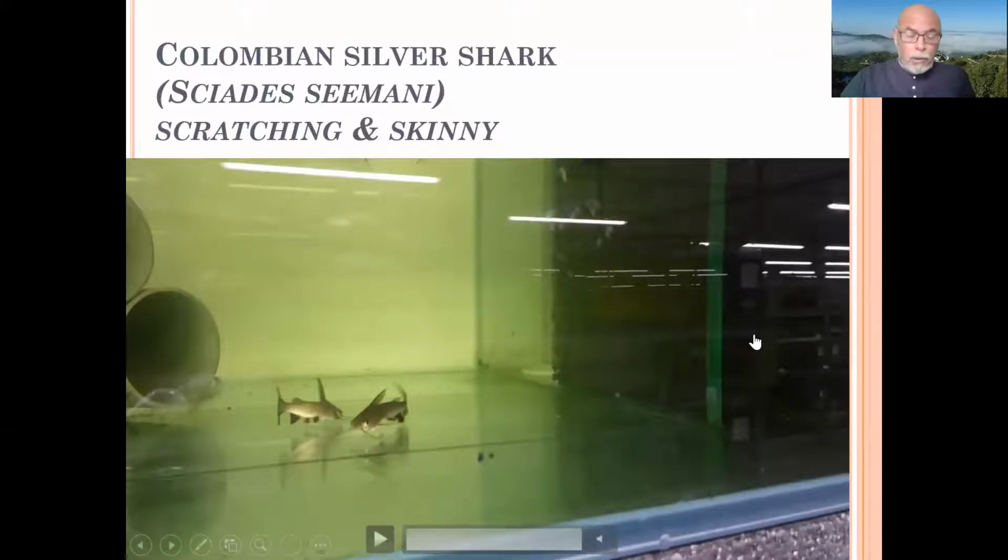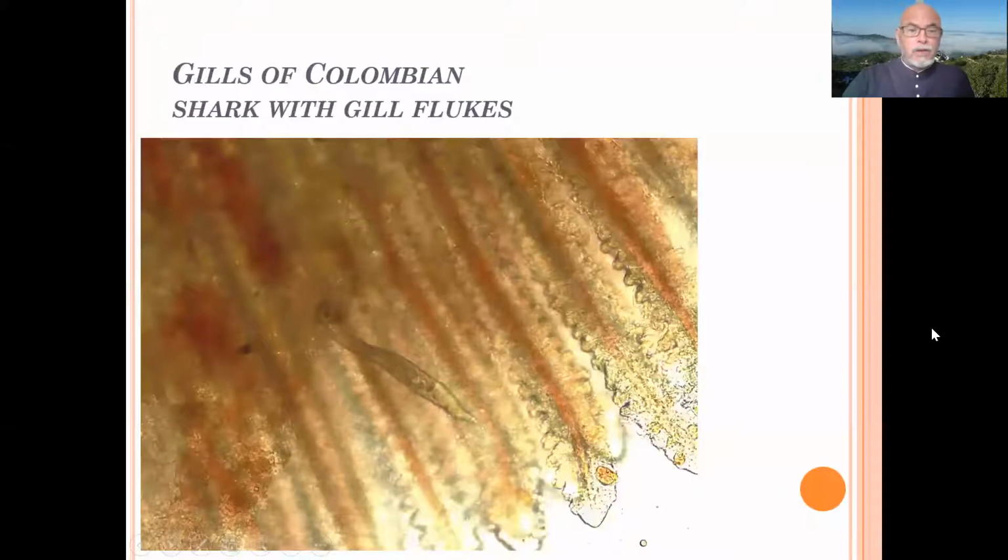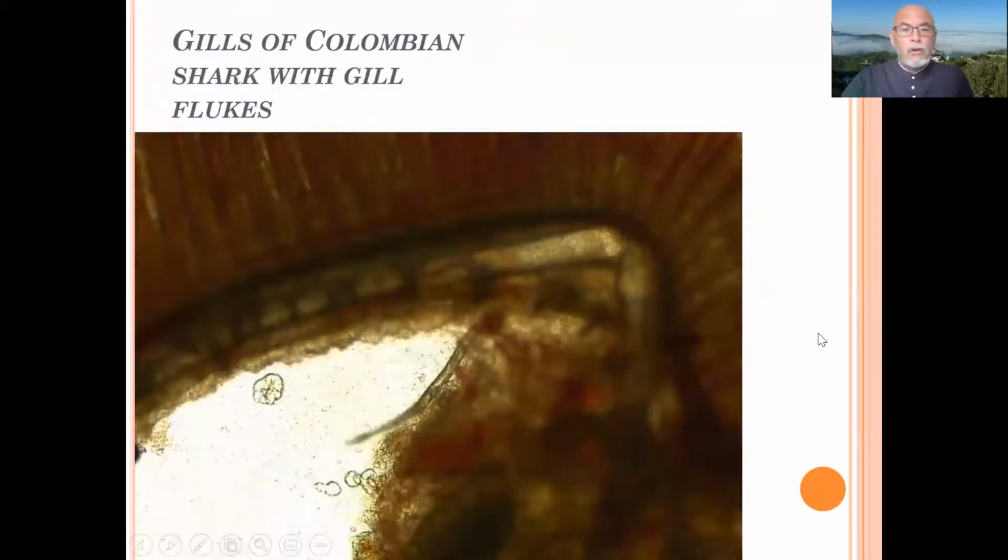So if you observe this, you might suspect there's something wrong in the gills. And that's what we found in the gills. We found some large gill flukes, which are luckily easy to observe, even with a small magnification, 50 or 100. You find these big gill flukes. What type it is, I don't diagnose, because there are so many different types of gill flukes, not only Dactylogyrus or Gyrodactylus, but many other ones. But at least we know it's a gill fluke, and then we know what to look for.